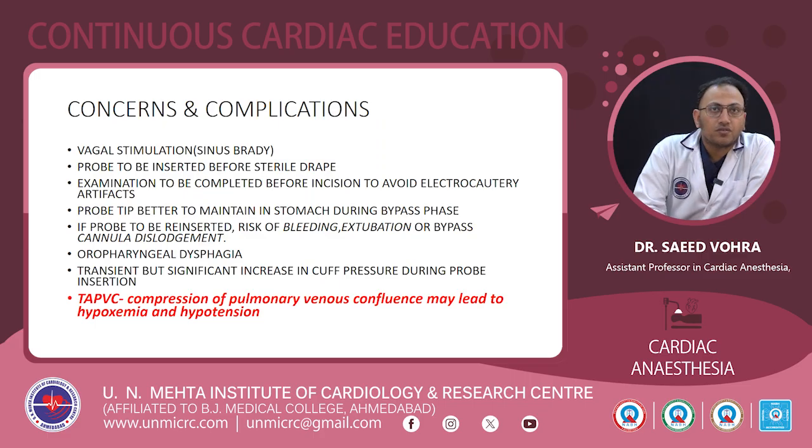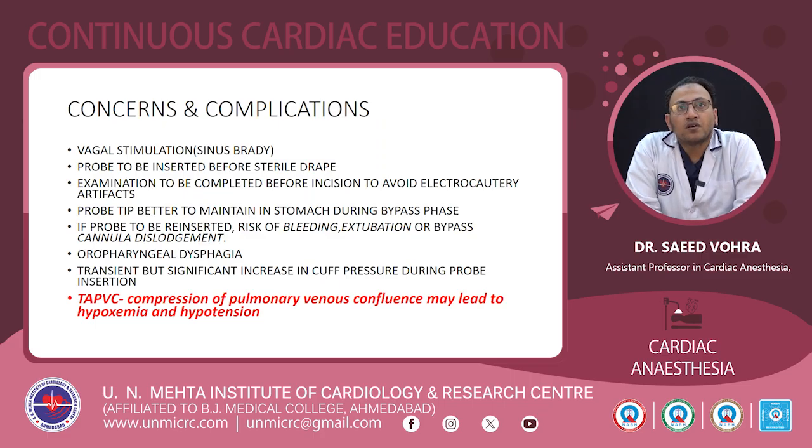Concerns and complications of TE in pediatric patients. The TE insertion can cause a vagal stimulation, which can lead to sinus bradycardia. And also the probe is to be inserted before the sterile draping is done, so that proper vision of the endotracheal tube can be done. Also, the examination is better to be completed before incision to avoid the electrocautery artifacts. So probe to be inserted before the draping and examination better to get completed before incision.